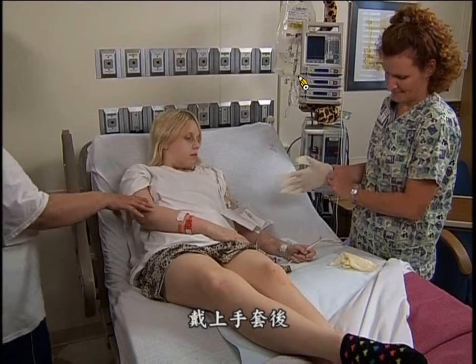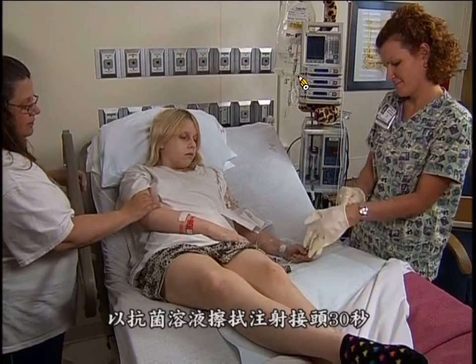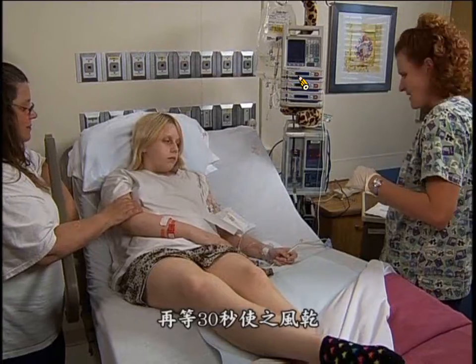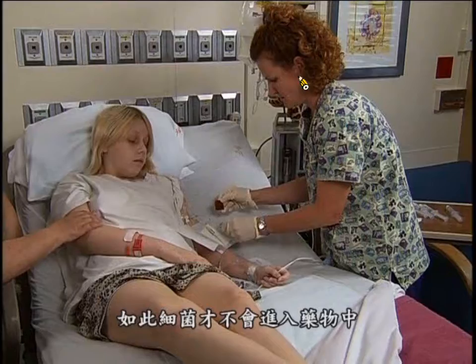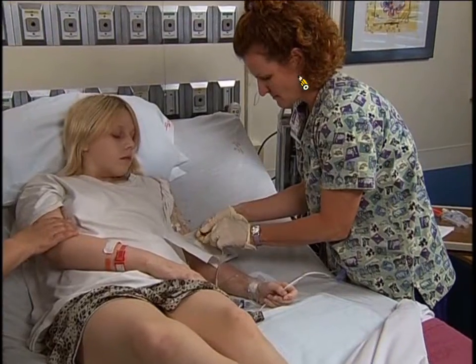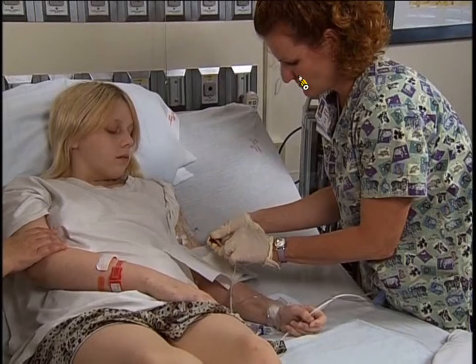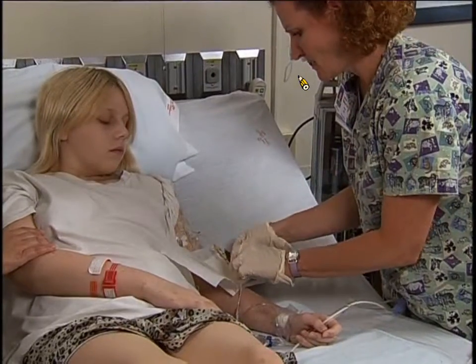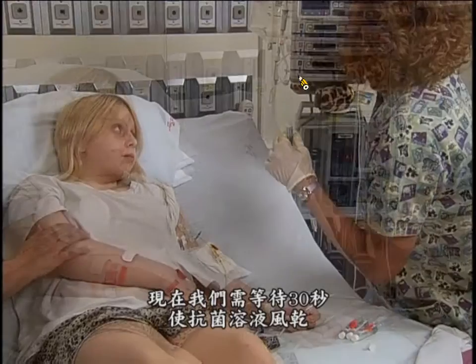After putting on gloves, scrub the injection surface with antiseptic solution for 30 seconds and let it air dry for another 30 seconds. I'm just going to clean this really good so we don't have any bacteria getting into your medication. And now we're going to let that cleanser dry for 30 seconds.